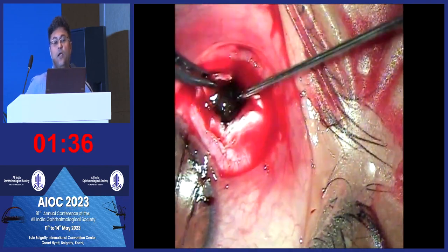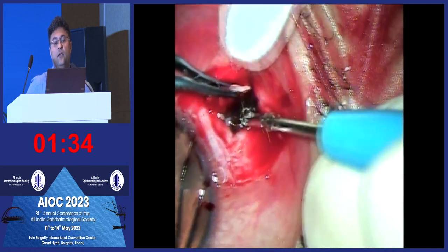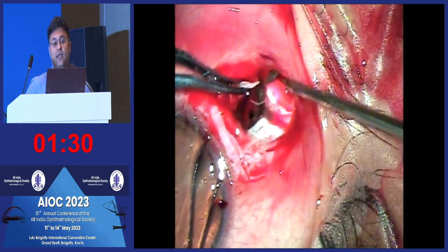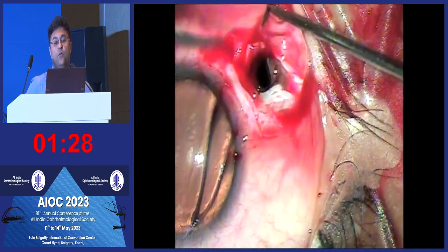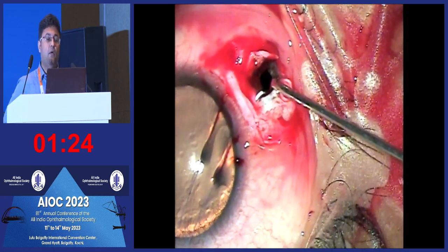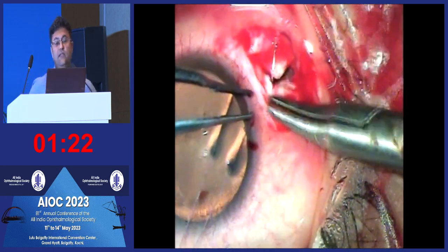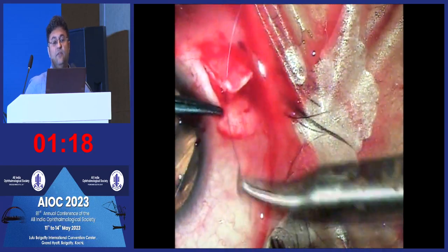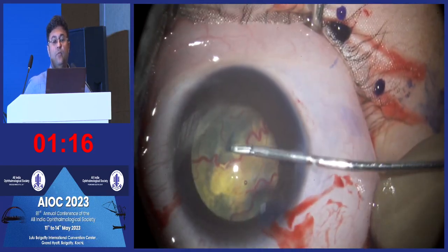We see the choroidal knuckle here. We cauterize it a little bit, make a small nick through it, and we go with our magnet, so to say, blindly, and there the foreign body comes out. So this is without actually going inside the eye. We do a little bit of vitrectomy around there. And we suture the deep flap first and then the superficial. The reason for making two flaps is that the first flap will act more like a trapdoor mechanism.